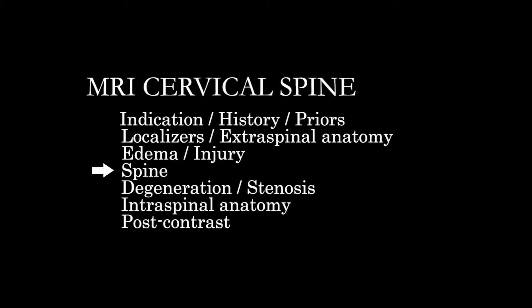Primarily looking at the T2s, we're going to take a look at the spinal anatomy, including alignment, abnormalities of morphology, any injury changes in vertebral body height, things like that. And then eventually assess for degeneration, stenosis, or any sort of spinal stenosis that results from the abnormalities that we're seeing.